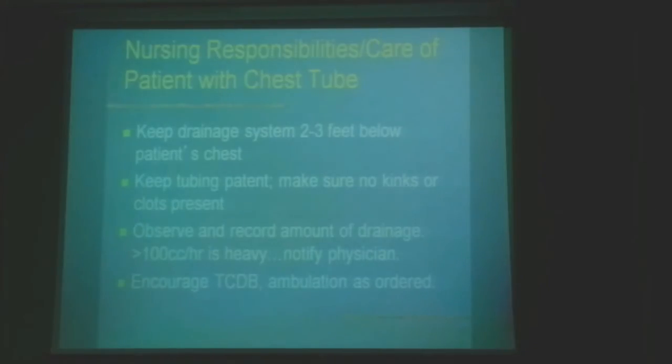Second most important thing. What? Hello? Kings, 20 minutes? This tube is kinked. It's not functioning anymore, right? So please, you called me 10 times or more over the last month. Pneumothorax. This tube is not working. The patient is collapsing. And I came and just found the tube is kinked below the patient. So before anything, you have to be sure the tube is not kinked. What else?